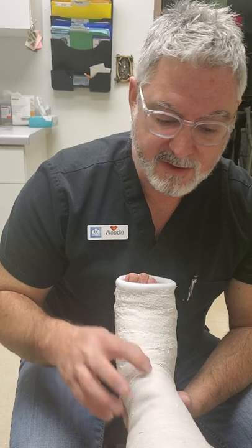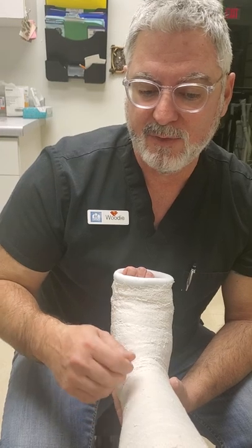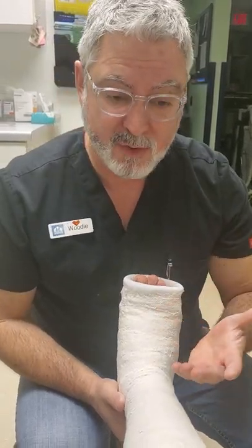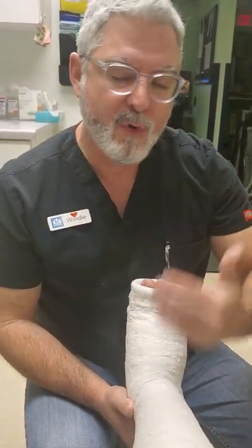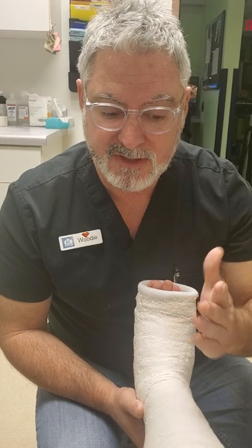However, when you are soaking — whether it's just water, water and vinegar, or water and fabric softener — be prepared to spend a fair amount of time removing that plaster cast at home. It's not going to just fall apart. You'll probably have to unravel some parts, and parts that you can't unravel you'll need to cut with safety scissors. If it's something you're doing at home, that's per the doctor's orders. Some doctors are totally fine with it and will let the parent or patient know: yes, the morning of your appointment or the night before, you have my permission to remove your cast. Other doctors will say the cast stays on until you come back to the office.